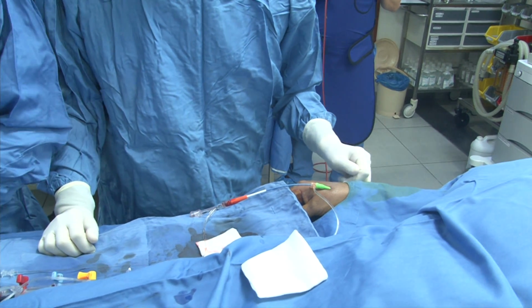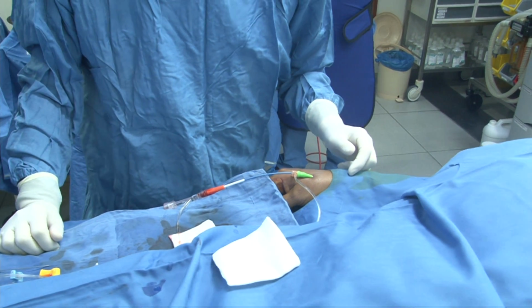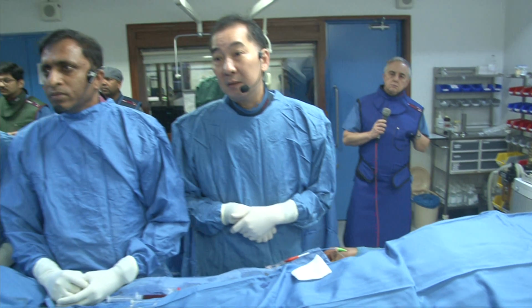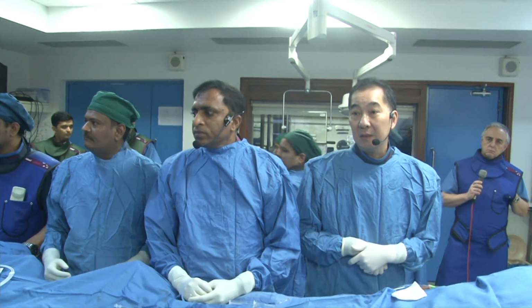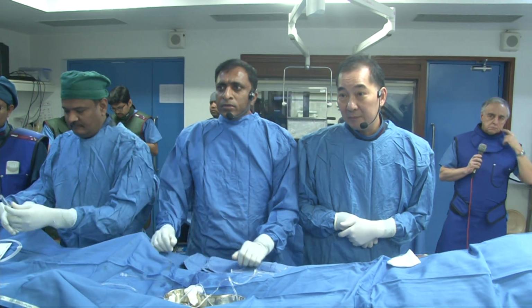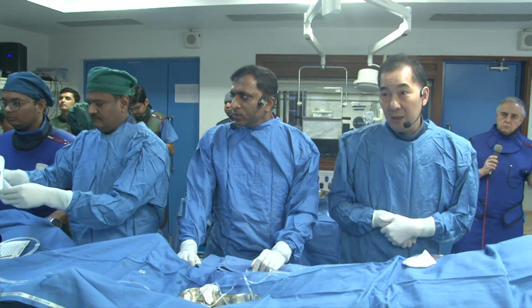Okay. So run the video. We put a JR4 in the right coronary artery. You can run it. You can see the distal bifurcation lesion, which is the intended treatment for this section.